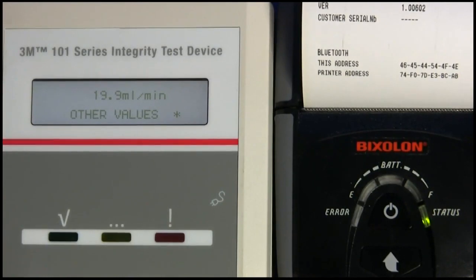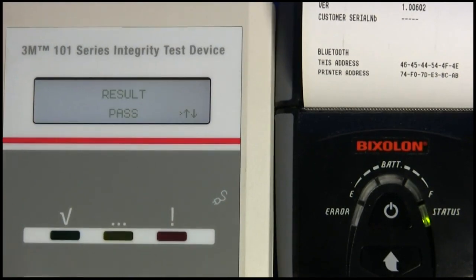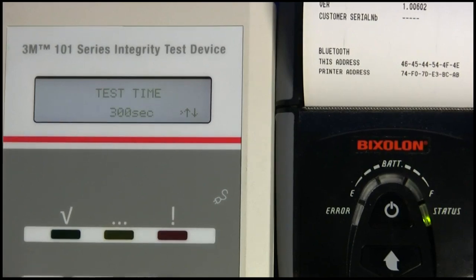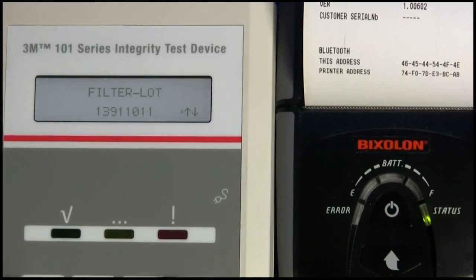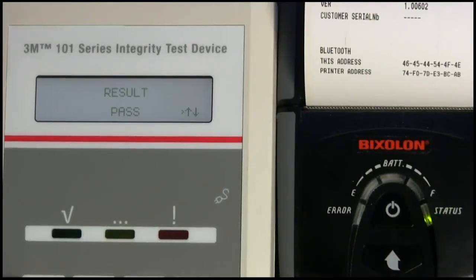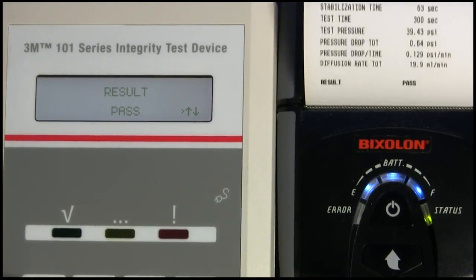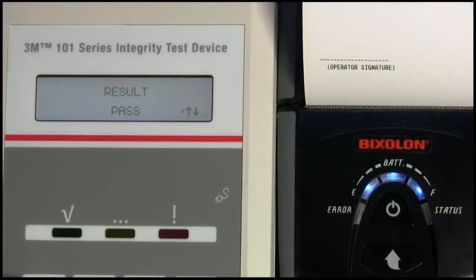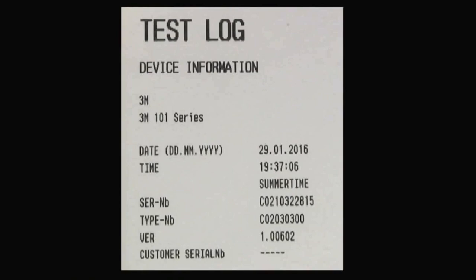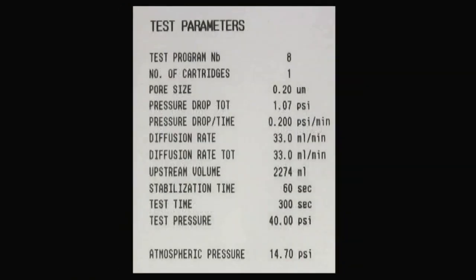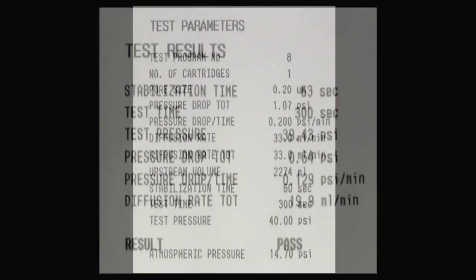Press the up arrow to return to the pass-fail status of the test. One can continue scrolling through key test parameters and results by pressing the up arrow. Alternatively, at any point when scrolling, Start can be pressed to print a hard copy of the test parameters and results. The hard copy is sectioned into several groupings, including device information, operator information, test parameters, and test results.